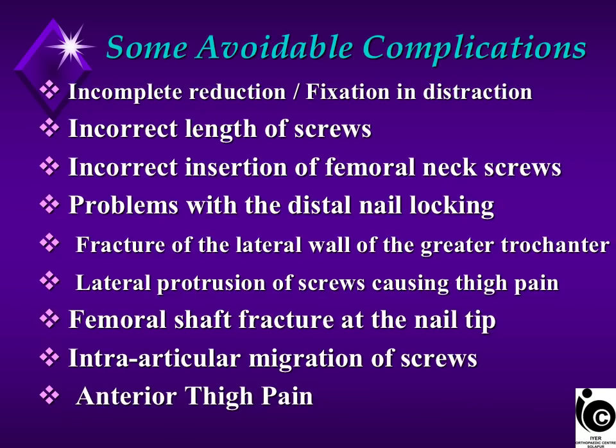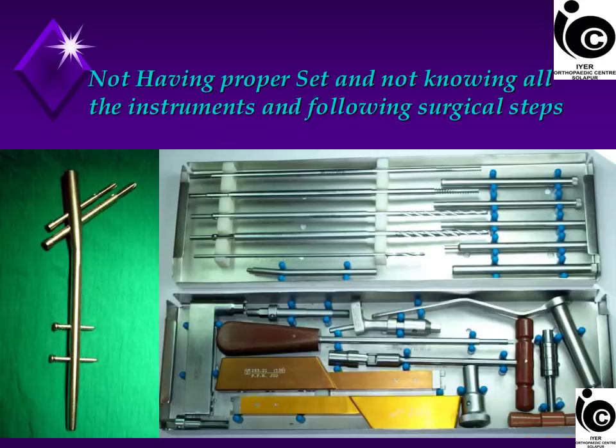It's a very busy slide. I will take each one of them subsequently. If we are doing interlocking nailing regularly, it's better to have your own personal set. The reason is the loaner set will have some instrument missing or not properly working, and you have to spend a lot of time struggling during surgery. So I advocate to you, purchase your own set.